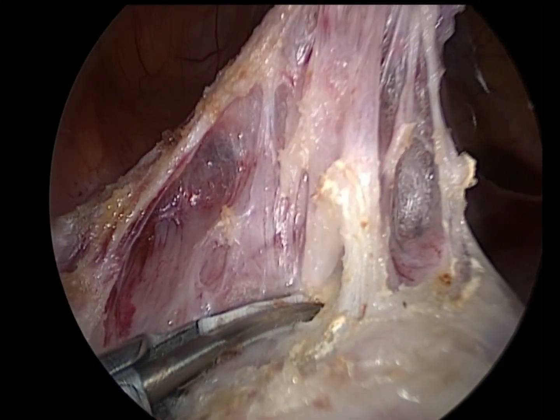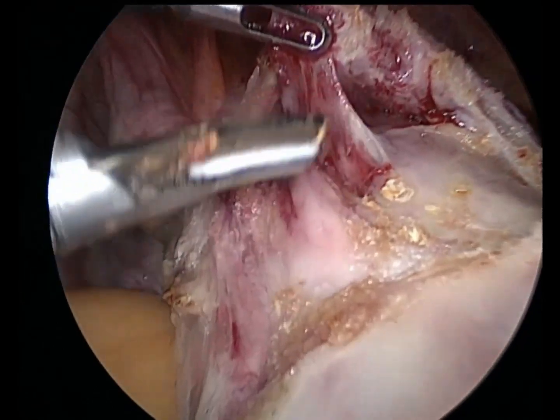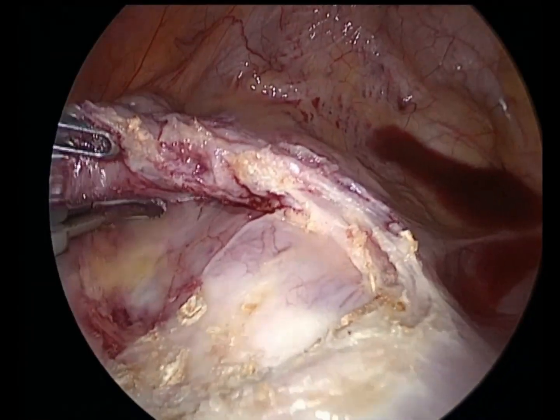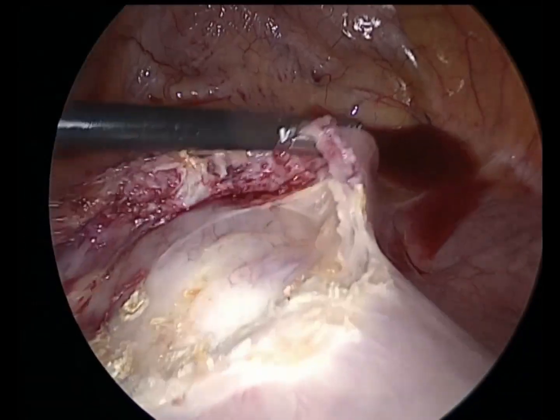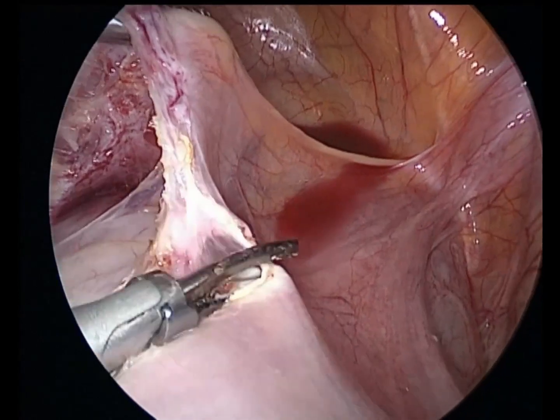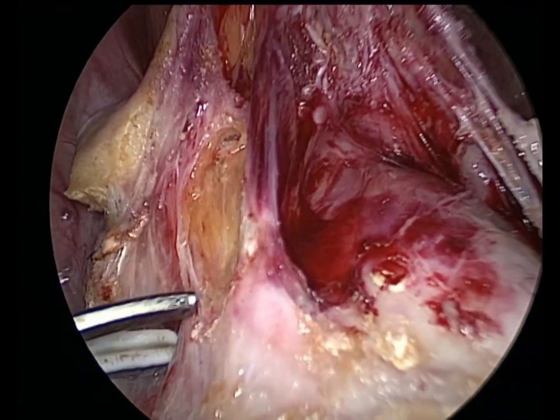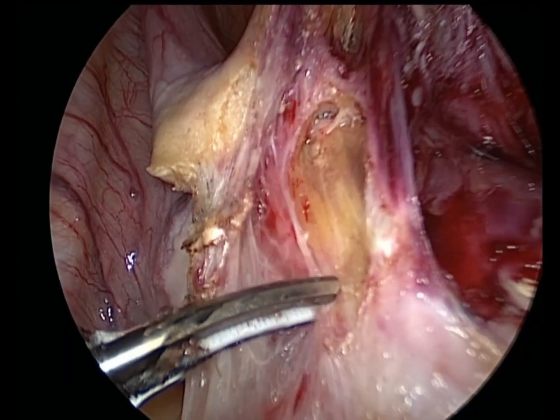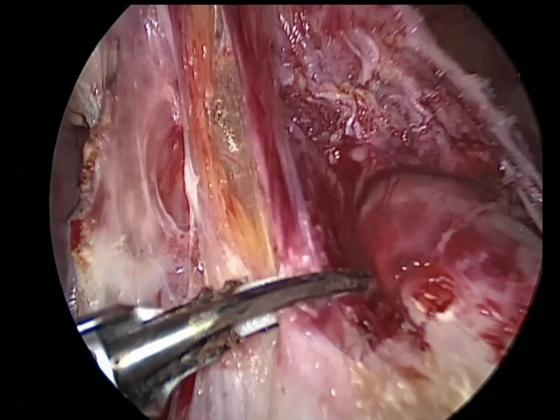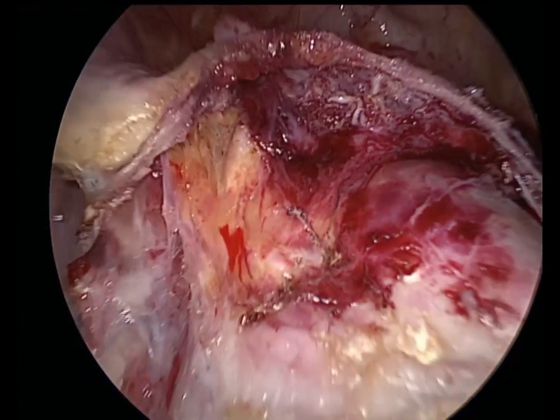Now, the cervix has come. You identify the cervix by the parallel blood vessels over its surface. Separate the bladder enough so that while coagulating the uterine arteries, you don't injure the bladder. You don't do any thermal damage to the bladder.